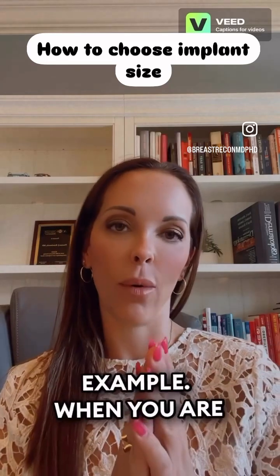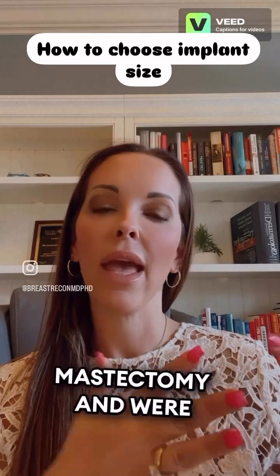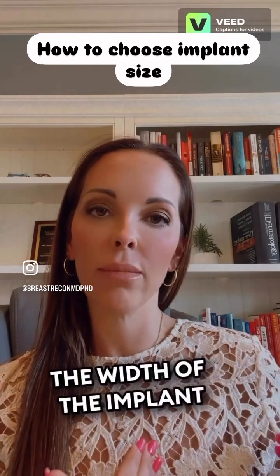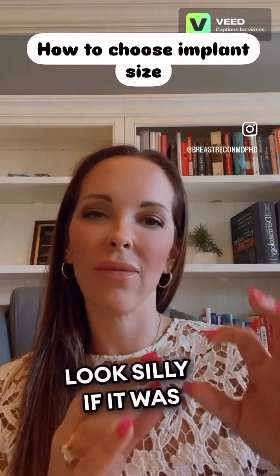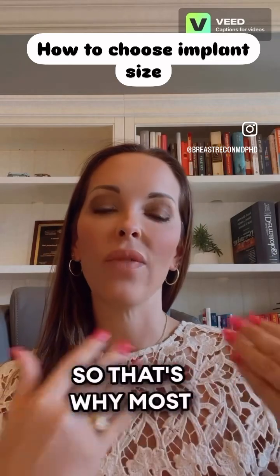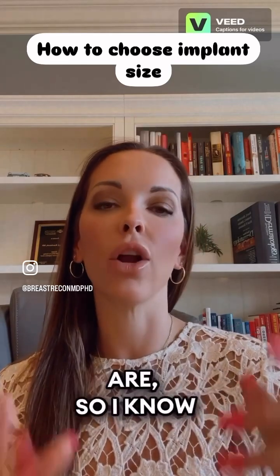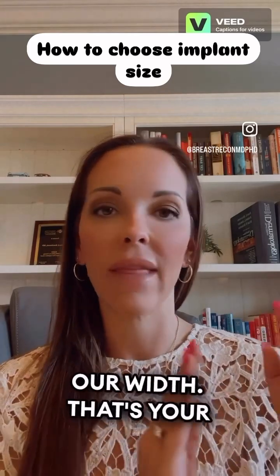Let's discuss an example. When you are having your breast reconstruction, if you had a mastectomy and we're replacing it with an implant, we want it to fit well on your body. So we want the width of the implant to be the width of your breast before surgery. It would look silly if it was narrow and was just sitting on the middle part of your breast. So that's why most surgeons measure base width of the breast as part of their workup. I need to see how wide your breasts are so I know how wide of an implant to choose. So we have our width, that's your anatomy.